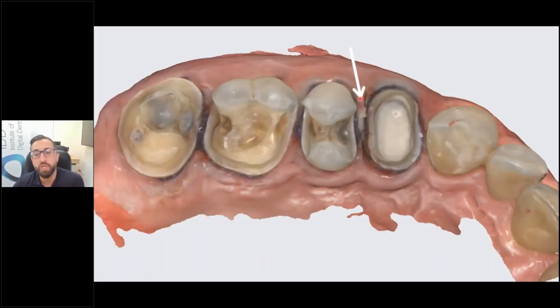Here's another example where the tissue may be slightly overlapping the area. With the software itself, you may get away with it and be able to cut this out, but you want to check these areas. After you take a scan, check the area very thoroughly — check the margins all the way around and make sure you don't have any missing data.